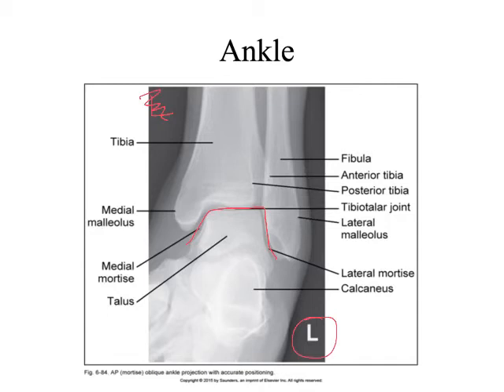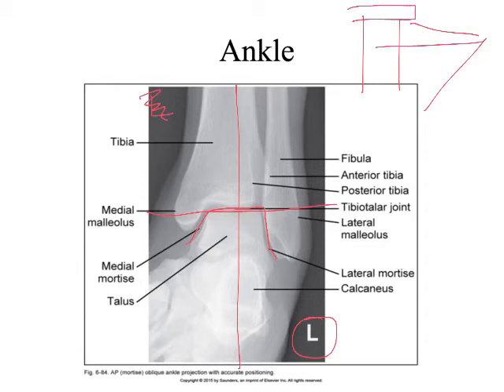We want to see a technique that allows for some soft tissue visualization. We want to be centered on that joint, and it is especially critical to be centered on this joint because, again, like what I was saying earlier about central ray divergence, if I'm not centered on that joint, central ray divergence could actually artificially close the joint. It's a very small joint, right? Y'all understand what I'm talking about? If say the ankle joint's way up here and I'm centered down here, I'm going to artificially close the joint space because of central ray divergence.